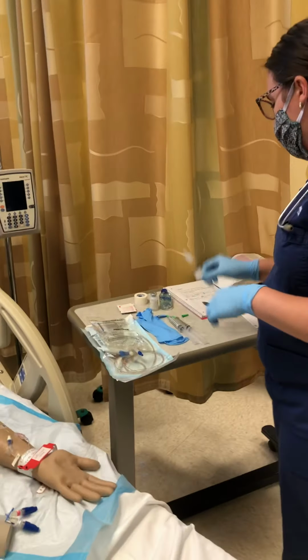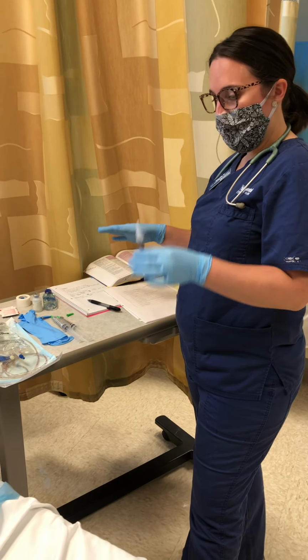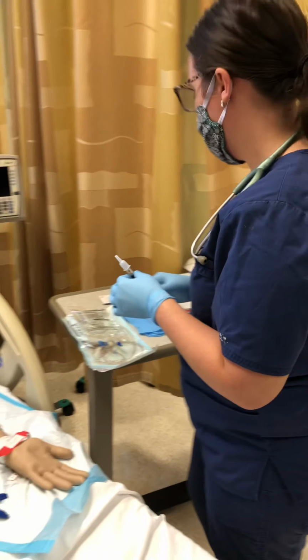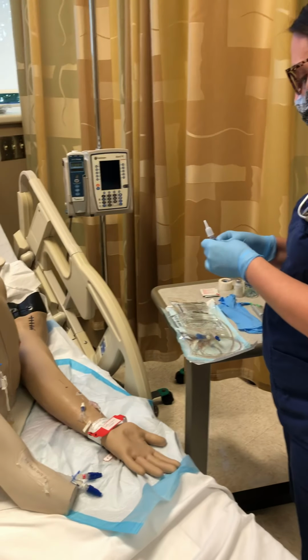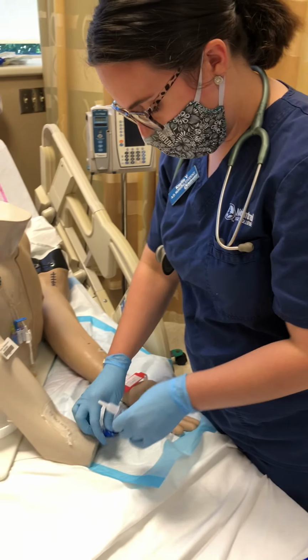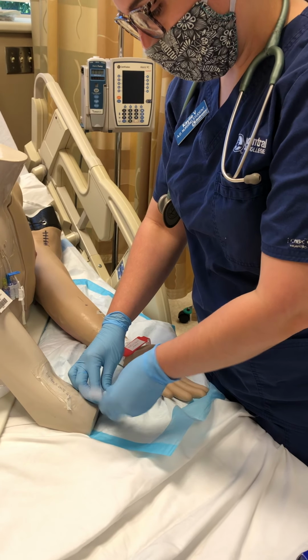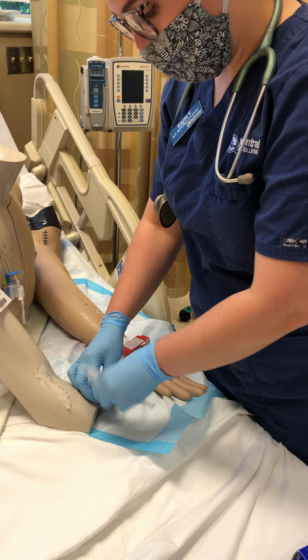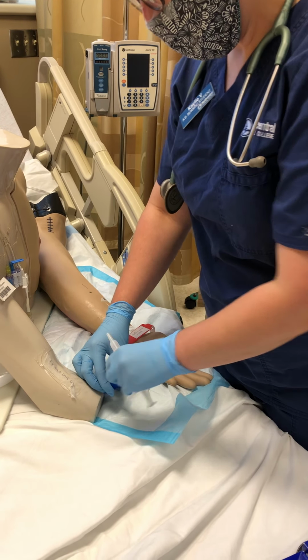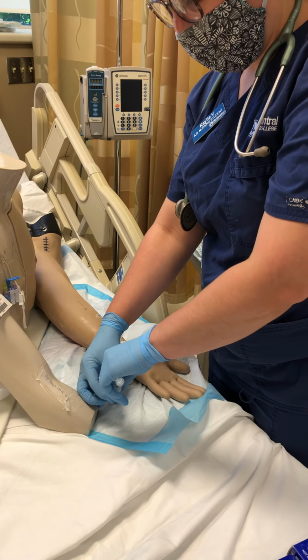All right, and then I'm going to do the furosemide. I checked in my book. It is compatible with normal saline. I'm also going to administer it over 1 minute. I'm going to use the clock over there. And as far as compatibility goes, we did find out that it's not compatible with a lot of antibiotics, which we're not using now, so it's fine. And same with normal saline, it is compatible with that. I can look at it before I do it.